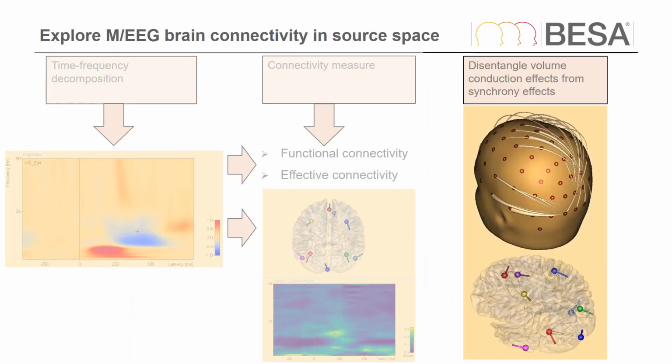The third ingredient that I would like to point out comes because of the issue of interrelations of channels. We were talking about interrelation of channel I to channel J, then there was channel K, etc. So ideally, we would really like to investigate just the information exchange between neural generators in the brain. Not so much what's going on at the scalp, where channels I, J, K may show us exactly the same brain activity, just propagated to the scalp.